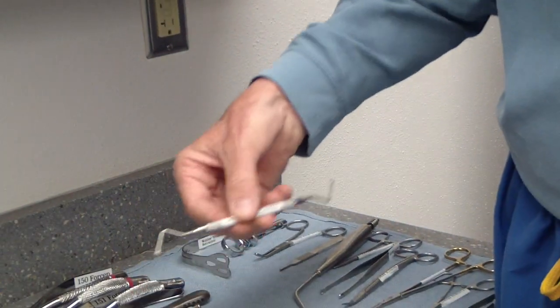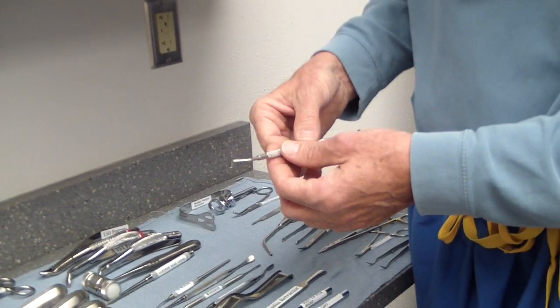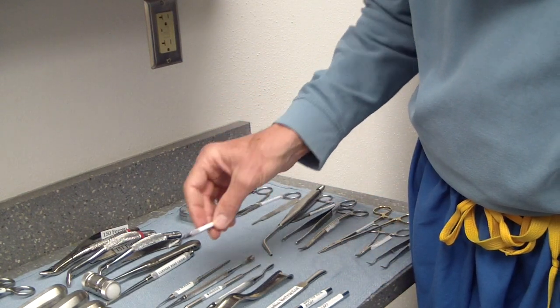This is your double-ended curette. When I curette out leftover granulation tissue or follicular material, it's left and right-handed depending on which end of the shaft you use. Very useful instrument.